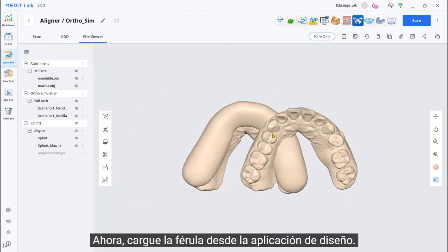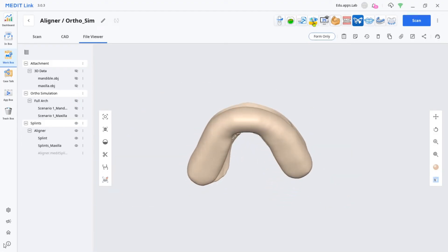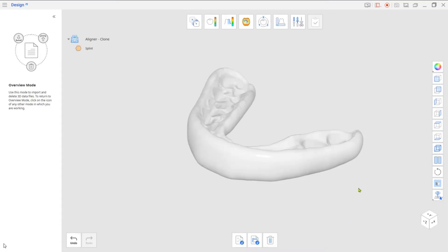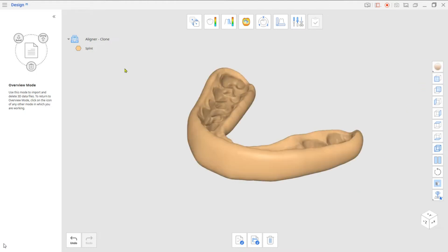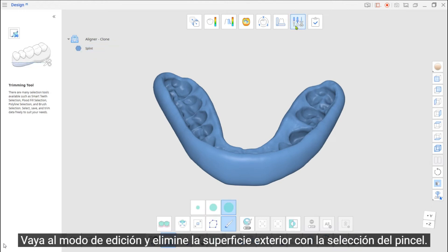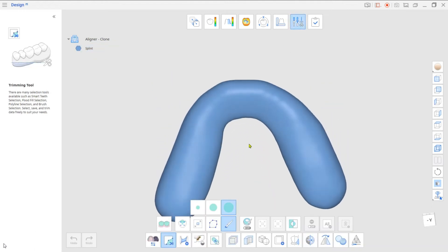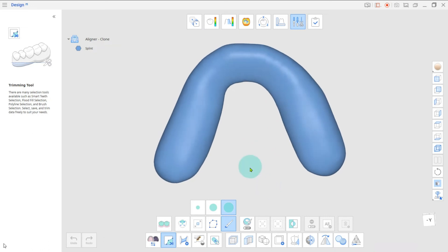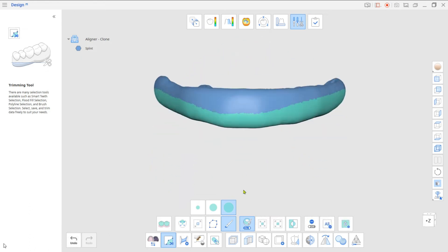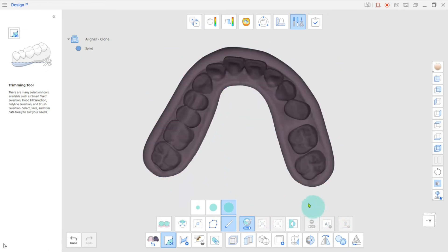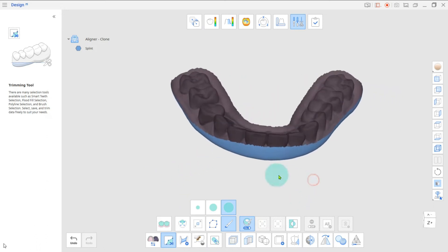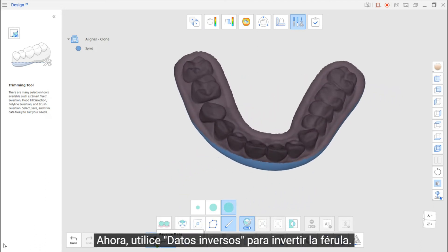Now, load the Splint from the Design App. Go to Edit Mode and remove the Outer Surface with the Brush Selection. Then use Reverse Data to invert the Splint.